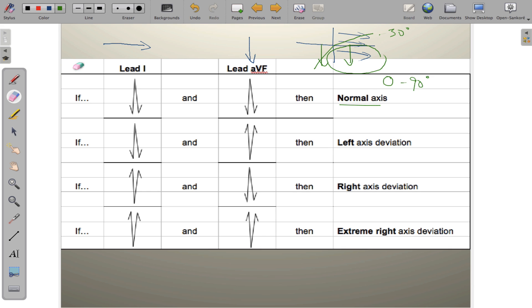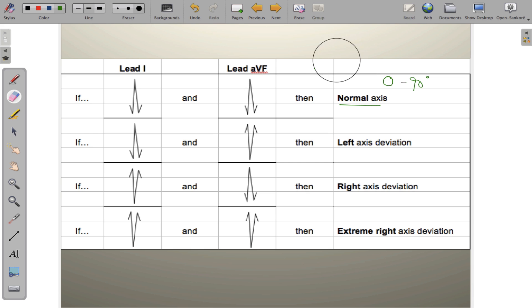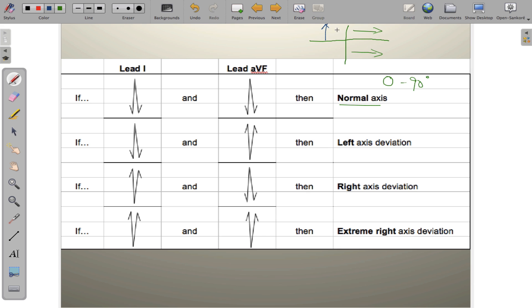Next: if we have a positive lead 1 (traveling toward the left arm) but a negative lead AVF (traveling upward, away from the feet), the overlap quadrant is between 0° and negative 90°. This is called left-axis deviation.